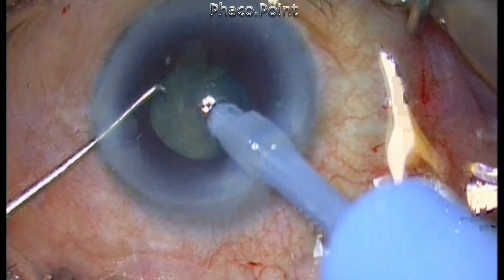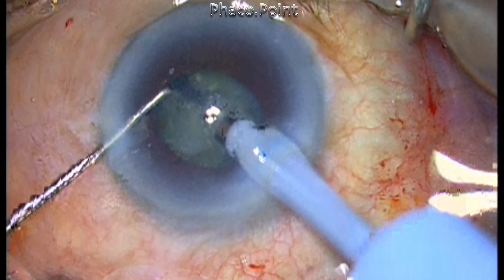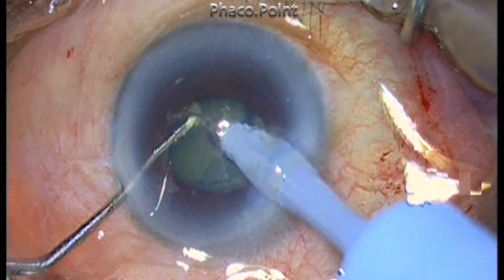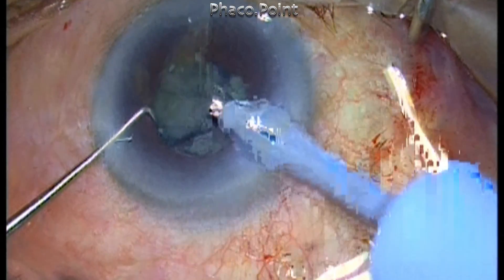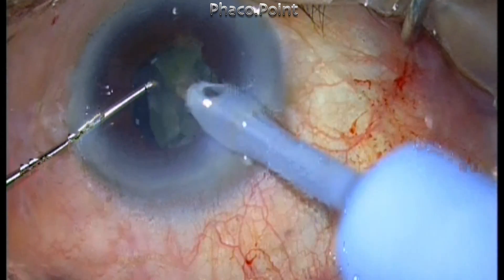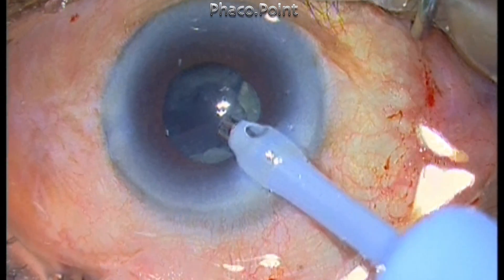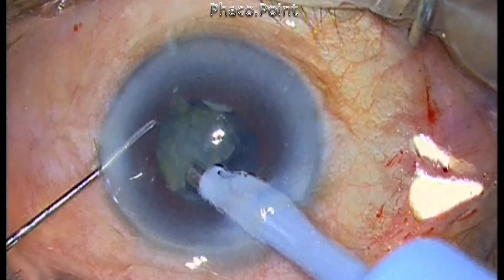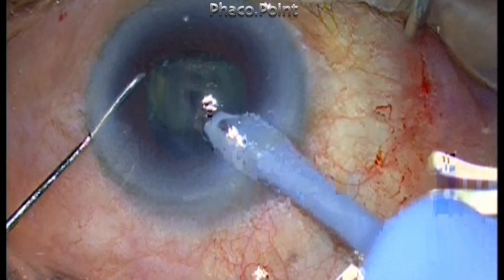The case is progressing quite uneventfully. The pupil has constricted slightly in this patient despite the epinephrine, due to the inflamed iris from the YAG peripheral iridotomy and the narrow angle glaucoma. However, it still remains within the comfortable realm of more than 3.5 mm throughout the surgical procedure. Nucleus management is completed by working within the central safe zone, using vacuum and short bursts of phaco energy to evacuate the nucleus fragments.